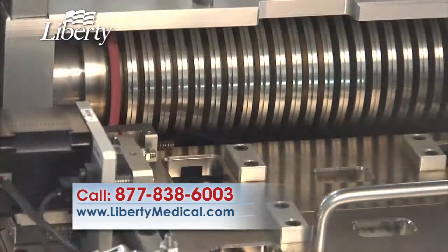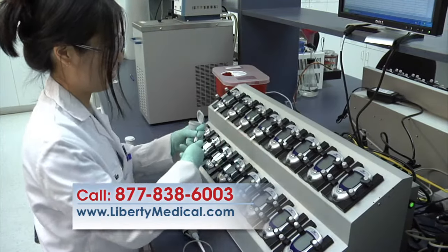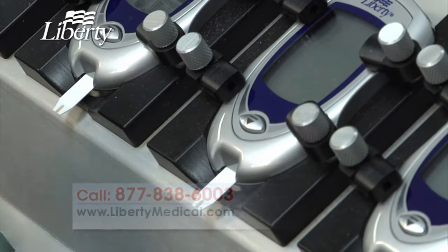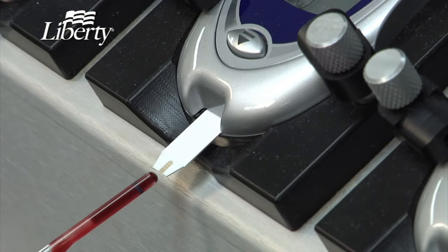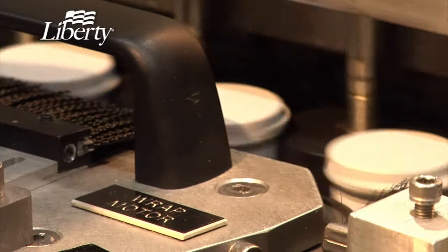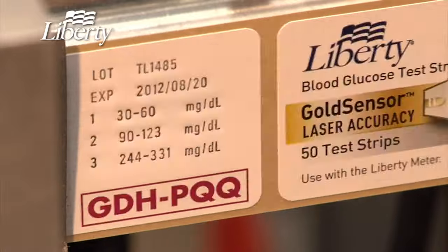The strips are cut with high-speed rotary blades into individual strips and inserted into test strip vials. During the manufacturing process, samples are sent to the quality control laboratory, where technicians use real blood to test the strips. In the packaging area, we apply labels, print expiration dates, and insert the strips into boxes.